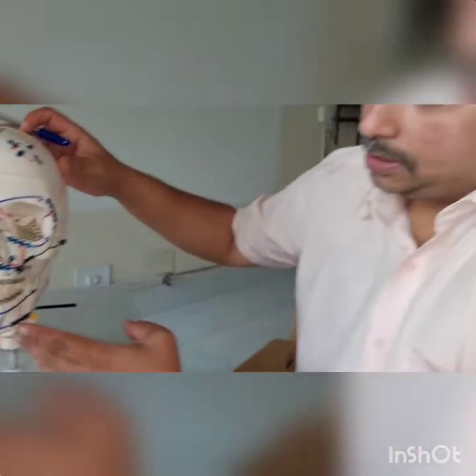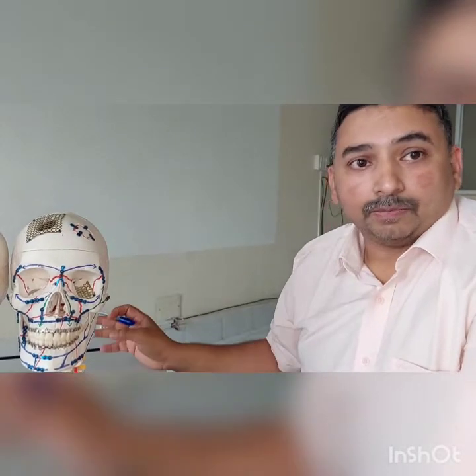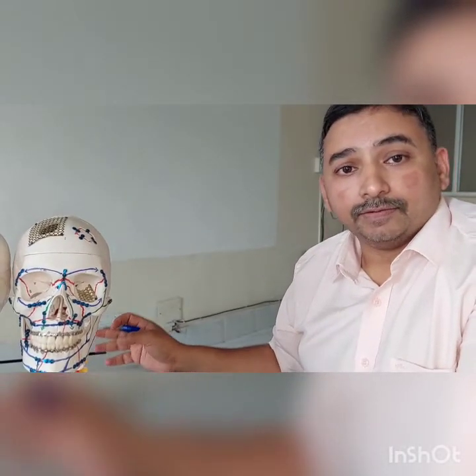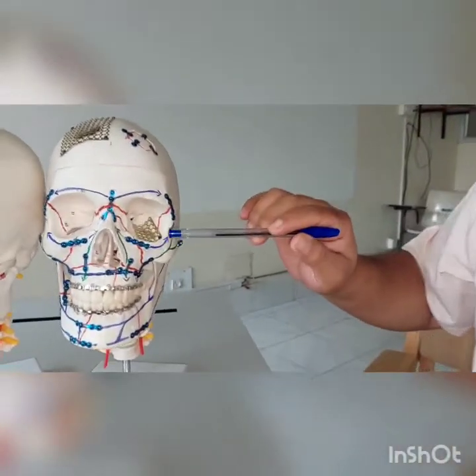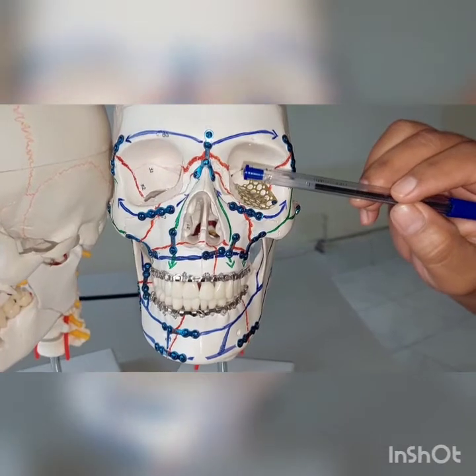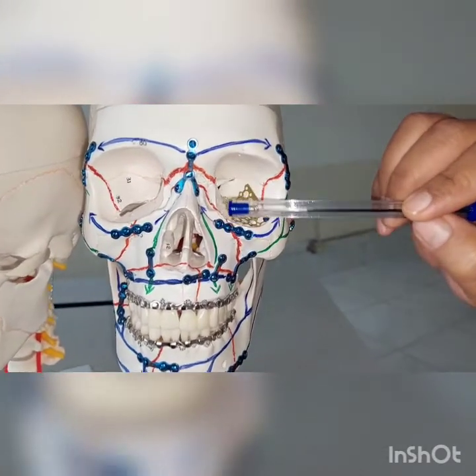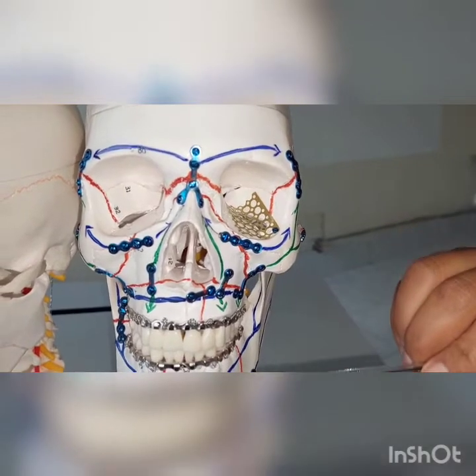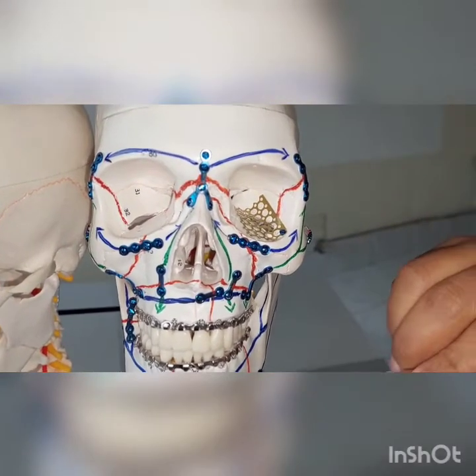treatment plan. The second model is a comprehensive treatment planning model based on evidence-based scientific principles. Here what you can see is 3 lines in 3 colors. One is a red line depicting the fracture lines, and the blue line and the green line.